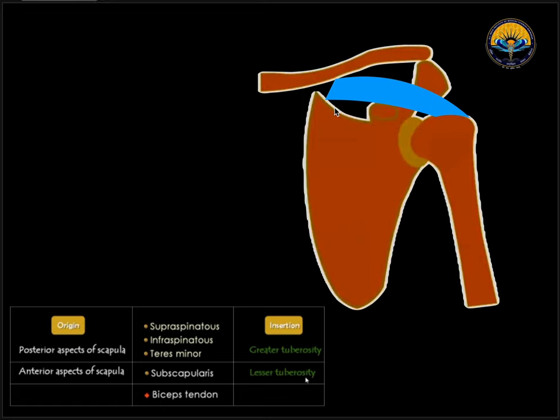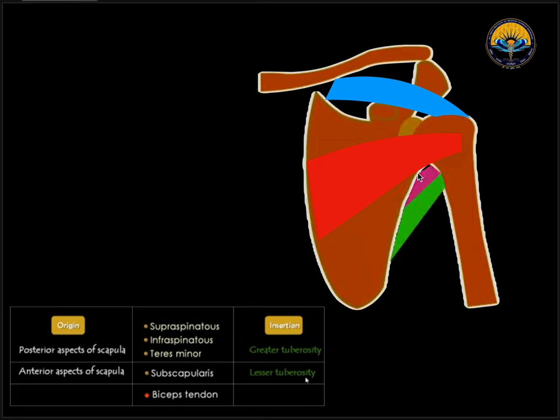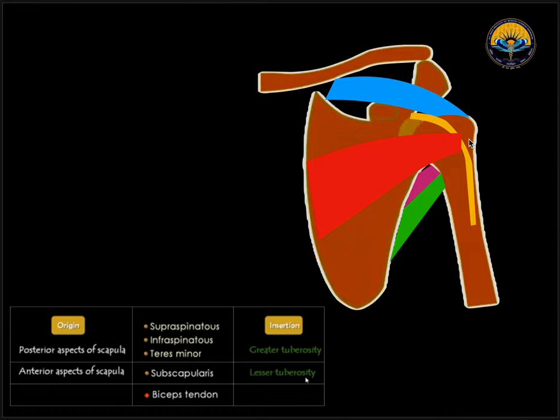We can see this is the muscle arising from the posterior aspect of the scapula and inserting on the greater tuberosity — this is the supraspinatus muscle. We can also see a muscle arising from the anterior aspect of the scapula, going and inserting on the lesser tuberosity — this is the subscapularis muscle. We can see muscles arising from the posterior aspect of the scapula and inserting on the greater tuberosity — these are infraspinatus and teres minor. And we can see a tendon going in the bicipital groove between the lesser and greater tuberosity — this is called the long head of the biceps tendon.